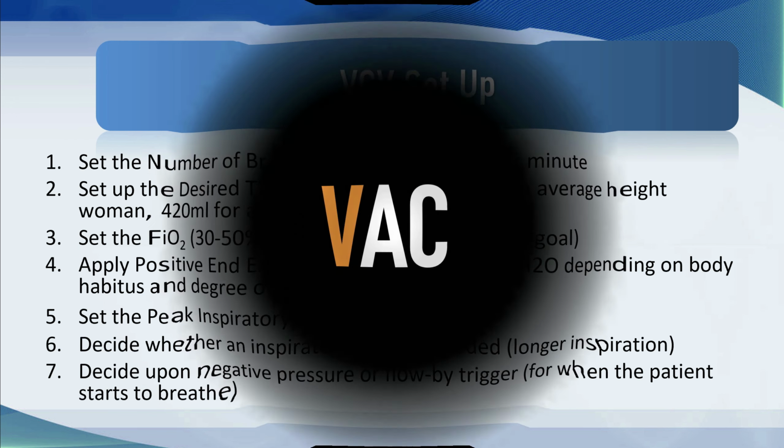Let's start with volume assist control ventilation. This is possibly the most popular control mode of ventilation in the world. It has a lot going for it, and I'm going to spend a little bit of time teasing through what actually goes on in volume assist control. Let's start with inspiration.